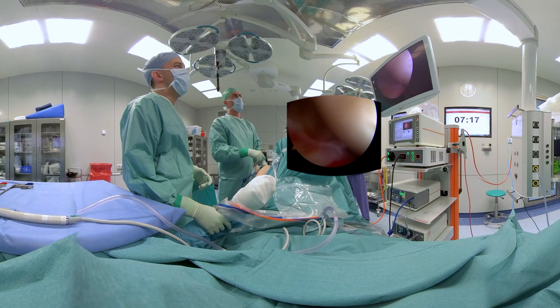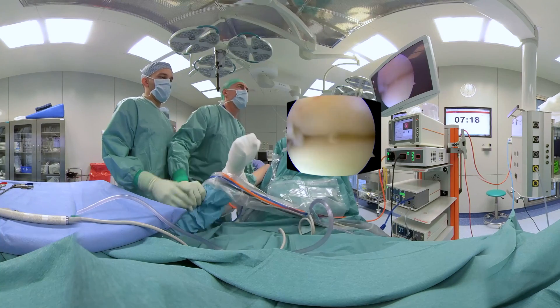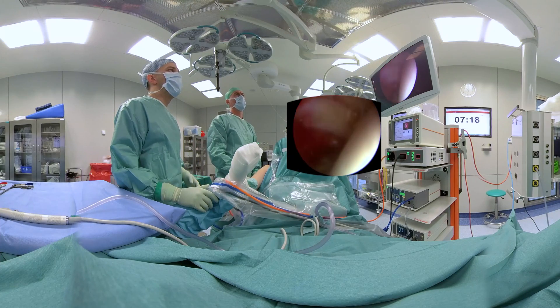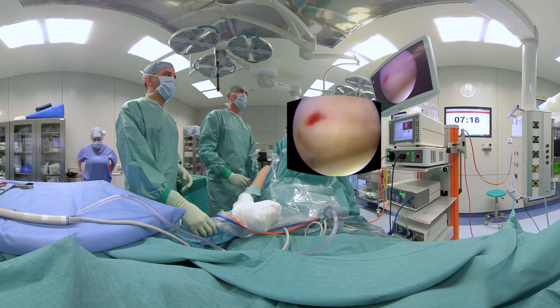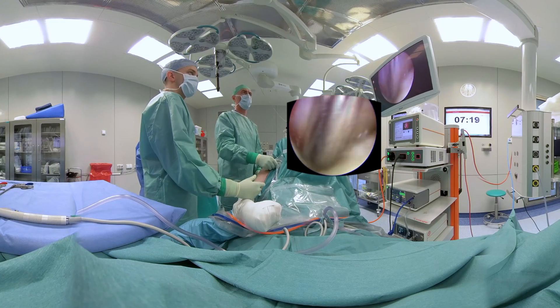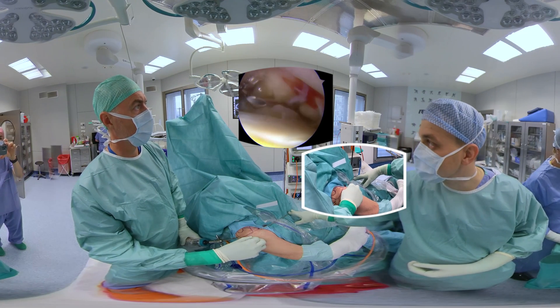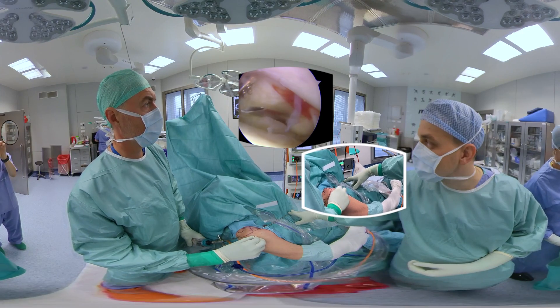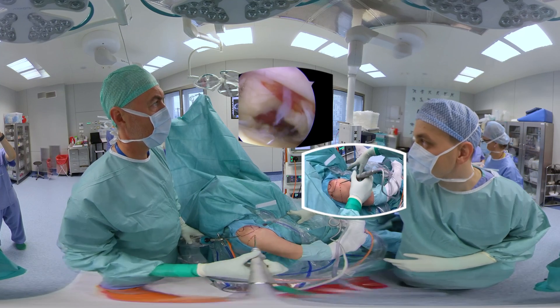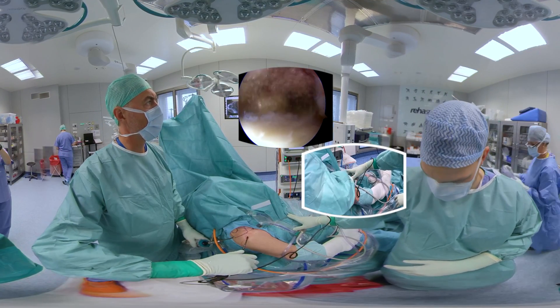After thorough intra-articular evaluation, the supraspinatus tear is identified from inside the joint. An additional anterolateral portal is created, and a shaver is used to debride both footprints and the edge of the supraspinatus tendon. Remnants of the soft tissues on the footprints are removed with the radiofrequency device.